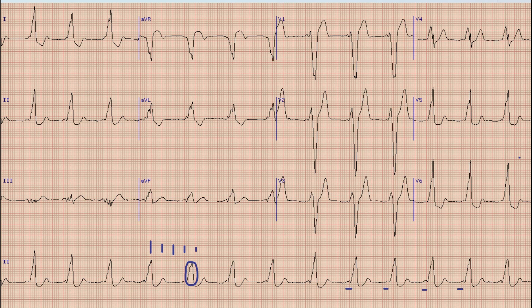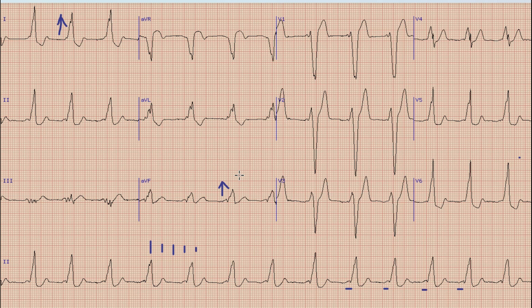The next step in ECG interpretation is axis. For axis, we look at lead I and lead aVF. In lead I, the direction of the QRS complex is upwards. Similarly, the QRS complex is directed upwards in lead aVF. By the rule of thumb, if both lead I and lead aVF have QRS complexes directed upwards, it means that the axis is normal.